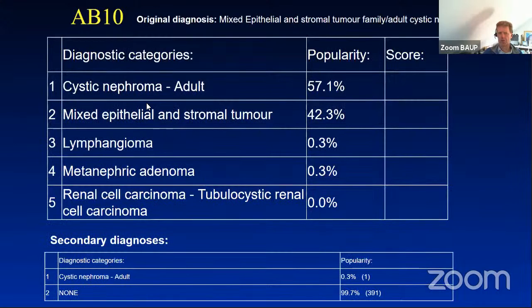And this is how we scored. As these two entities are pretty much the same, depending on how you define how many cysts, and that's not really well defined, then it would seem logical to merge these two. And then the other ones, these two differentials are incorrect. And then the last one, I think is a differential. Someone's put in a trainee, but it's clearly not one of those. So if we merge these two, we should be able to score it with enough agreement.